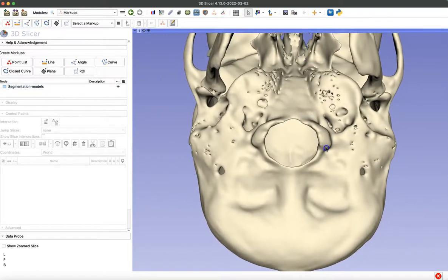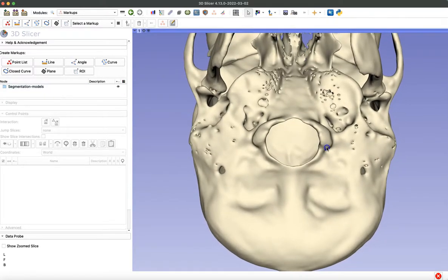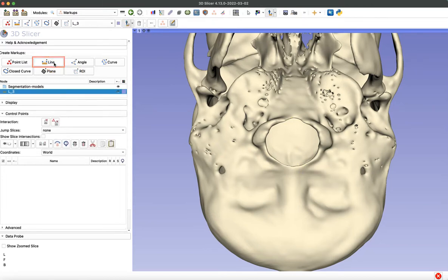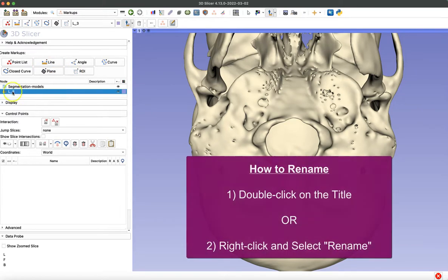So we're going to take a length measurement of the foramen magnum from the points basion to opisthion. So when you're ready, you simply select the line icon and then rename it something distinctive so you can tell it apart from your other measurements.